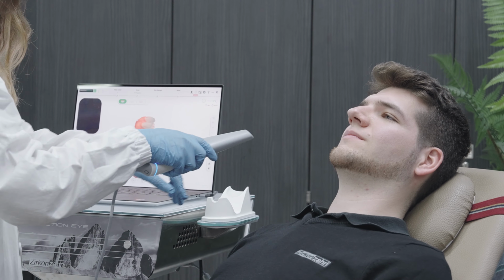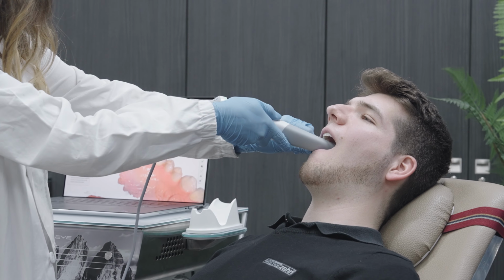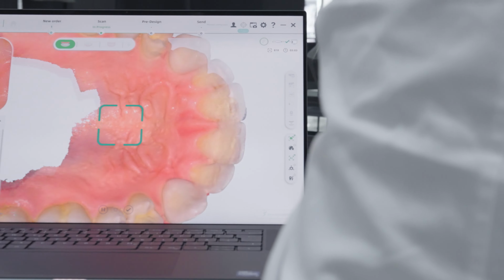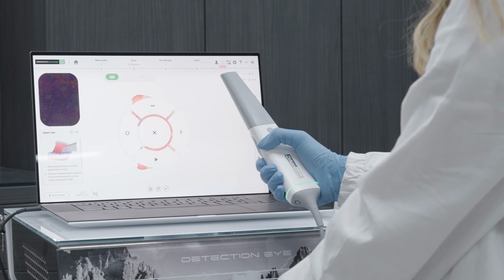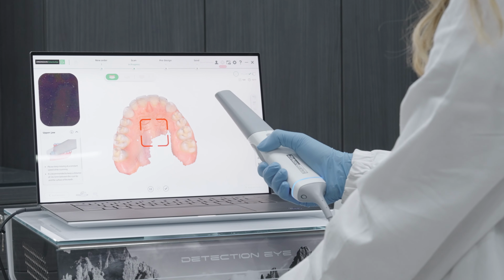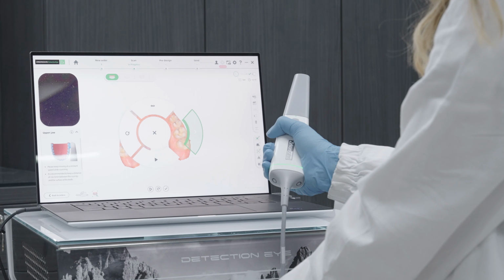If this is the case, the scan process can be continued directly without clicking or pressing other buttons. If the scanner is moved downwards, the scan process can be paused or started again. To proceed with the next scan, just move the scanner rightward.